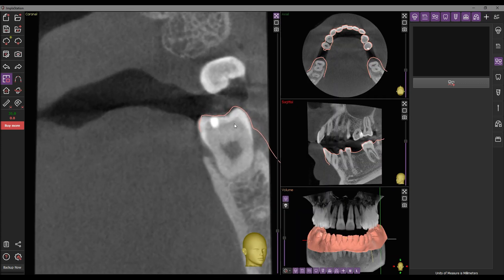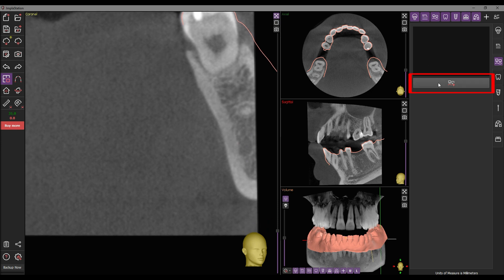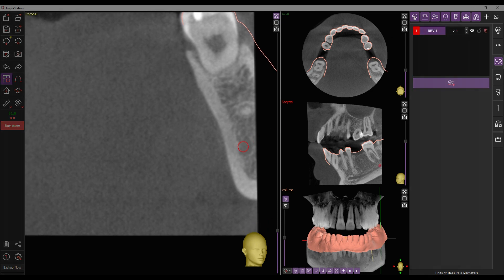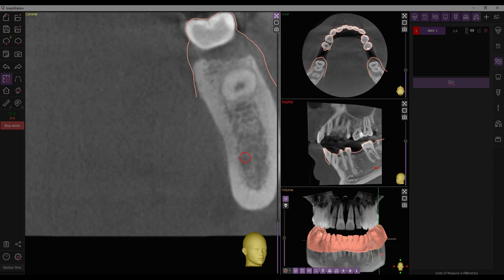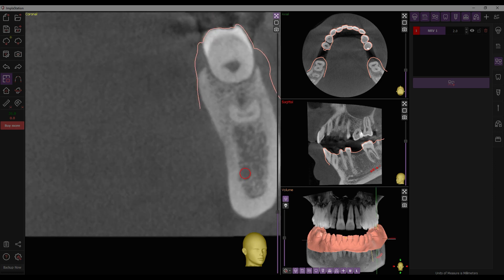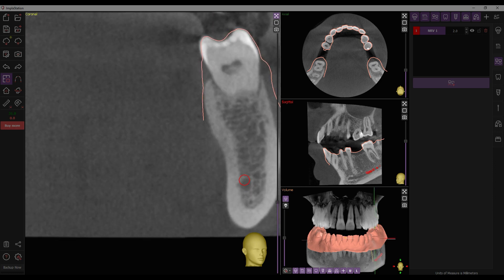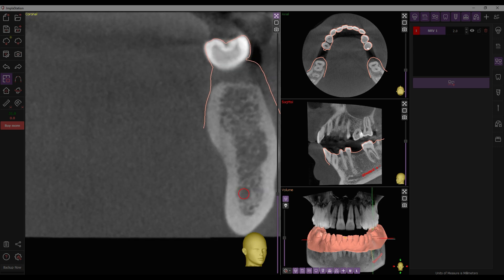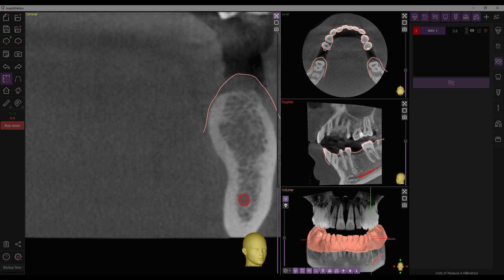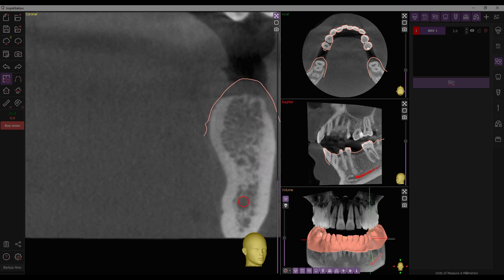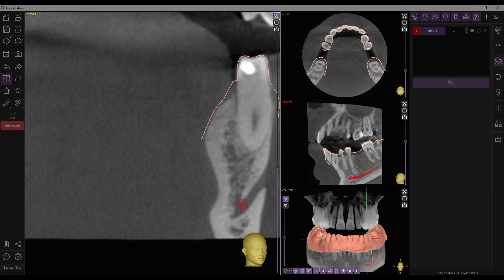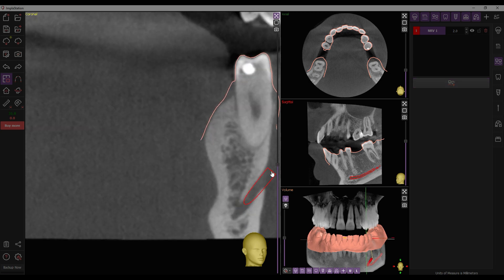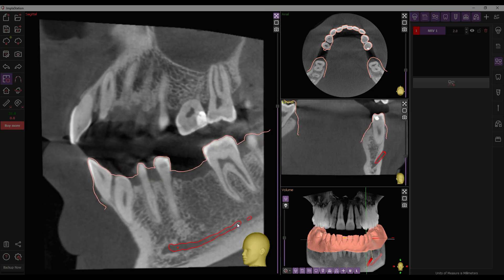Click on the Draw New Nerve button — this action will initiate the tracing process. Use a special marker to mark the nerve's location. If needed, adjust the marker thickness in the program settings. Draw the nerve gradually, scrolling and tracing throughout the canal, moving along the section. To finish, simply double-click on the endpoint, and the created canal will be added to the list.